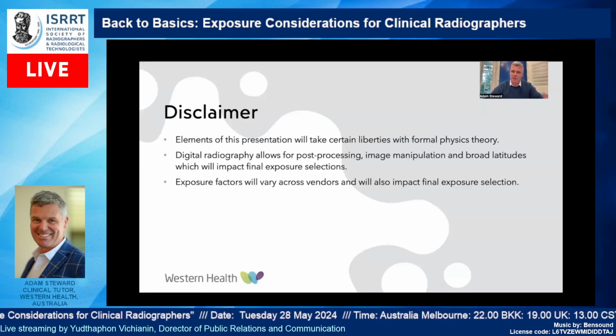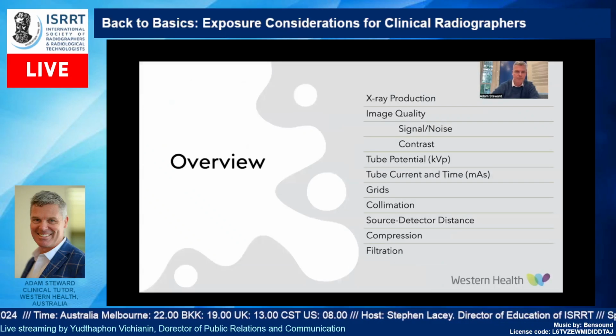That holds true with different vendors. Different systems may have different settings and different post-processing that will ultimately impact the final exposure selection, and you should be very aware of that when you're using some of what I'm talking about today.